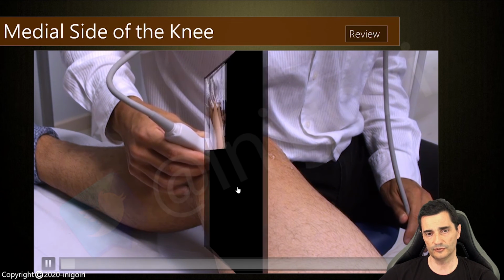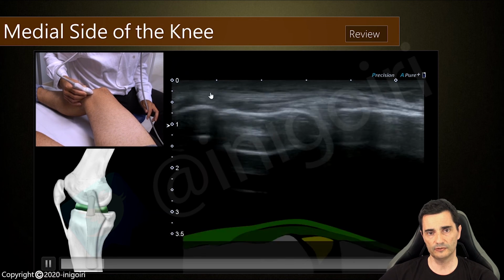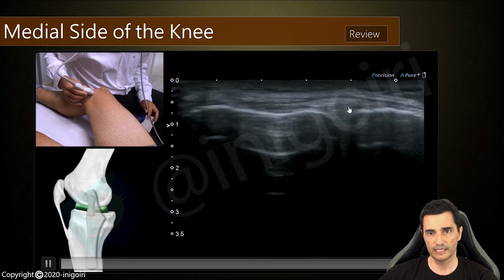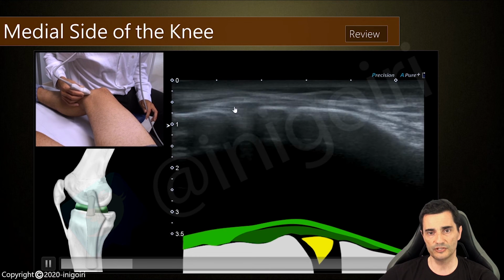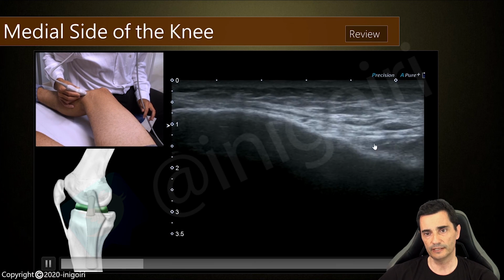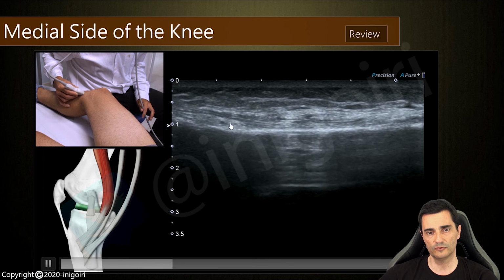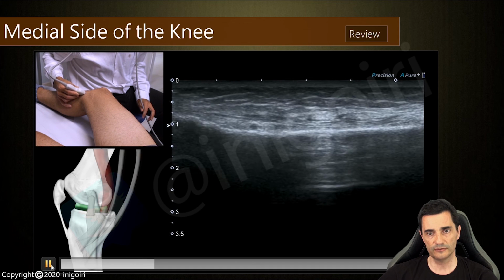We start at the medial joint line, and here you have the insertion of the medial collateral ligament on the epicondyle. You can see here the fascicular component of the superficial layer, here the meniscofemoral component, and the meniscotibial here, and its relationship with the medial meniscus. If we go distal, always check to have a good view of the cortical of the tibia here. And now you can see the inferior medial genicular artery, and the nerve should be located here. And again, this is the medial collateral ligament and its superficial component, and the relationship with these two tendons here.